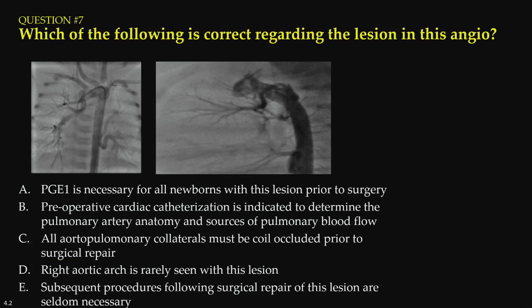Do we see that lesion in pulmonary atresia with intact ventricular septum? Very, very rarely, if at all. It depends on when the pulmonary atresia developed and whether there was flow, but the classic angiogram there is from pulmonary atresia with a VSD, so you'll have the potential for repair, or maybe I get to that, so I won't go through it.